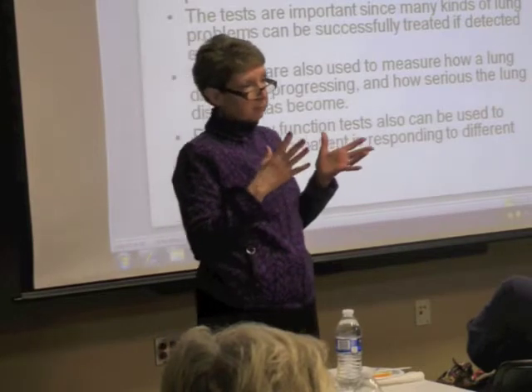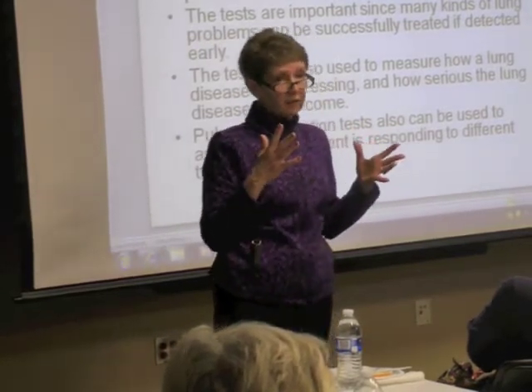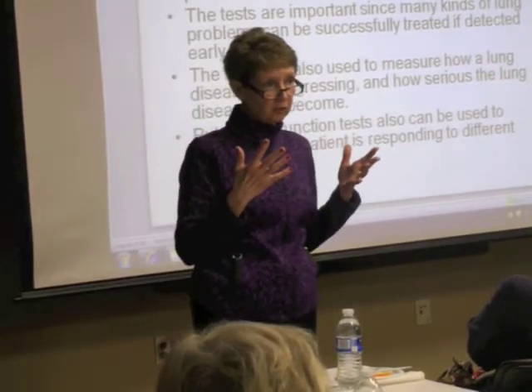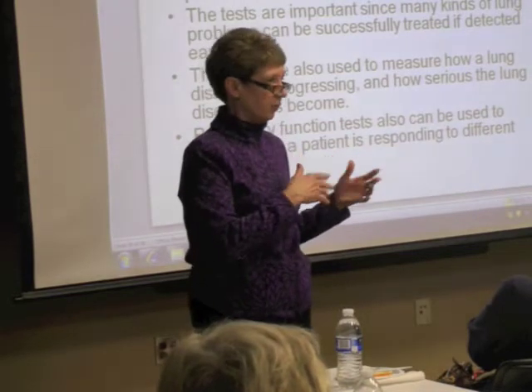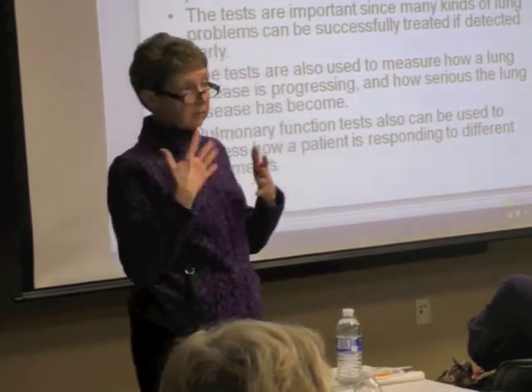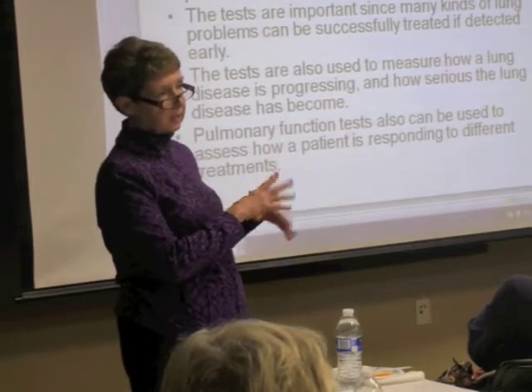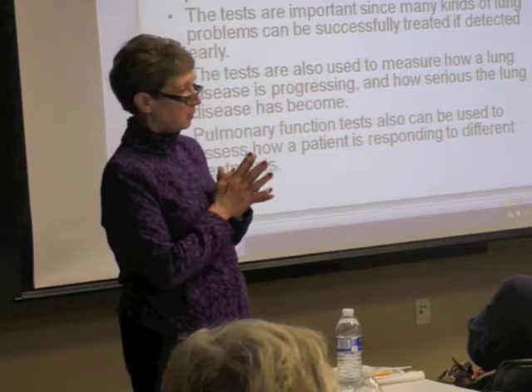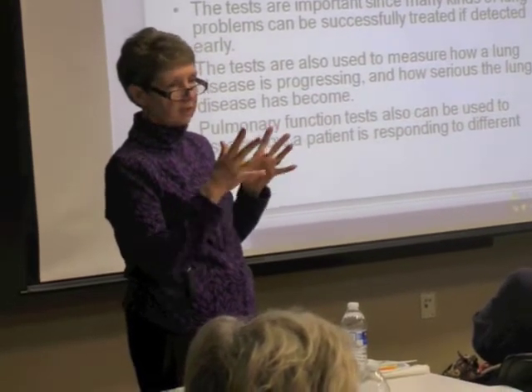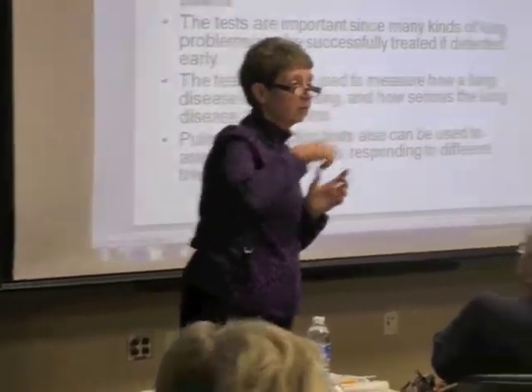Speaking of blood gases, most of you, especially those of you on oxygen, that is another lung test. And we do a lot of exercise testing as well. We do blood gases at rest, blood gases with exercise. There are a lot of different types of pulmonary functions. This is just the basic. You come in and you sit in the machine and spend about 45 minutes with us, and we give the doctor a lot of detailed information. But there are many other tests we can do as well.